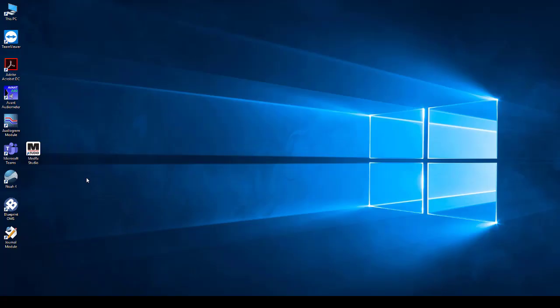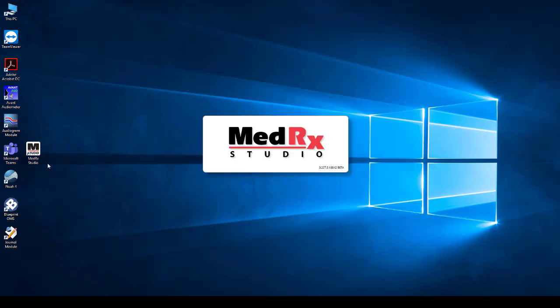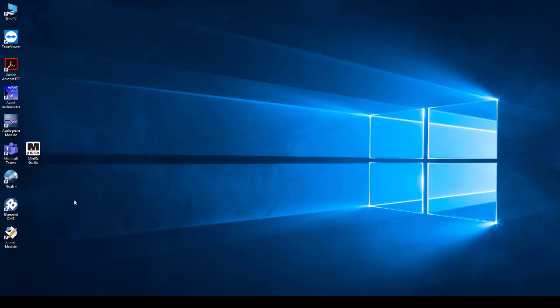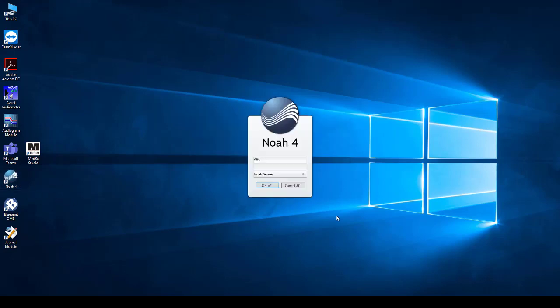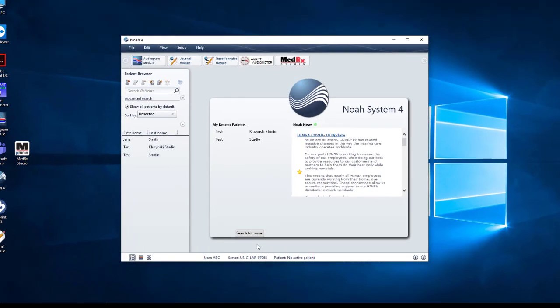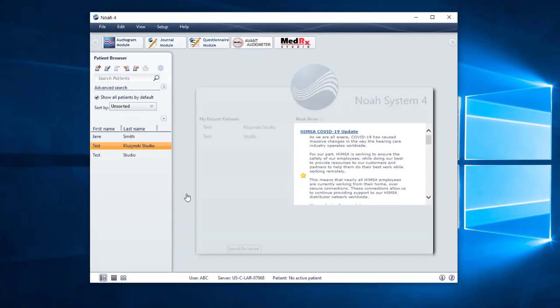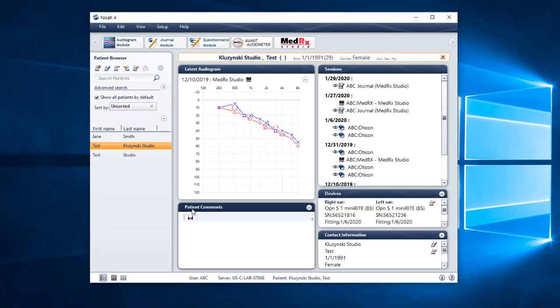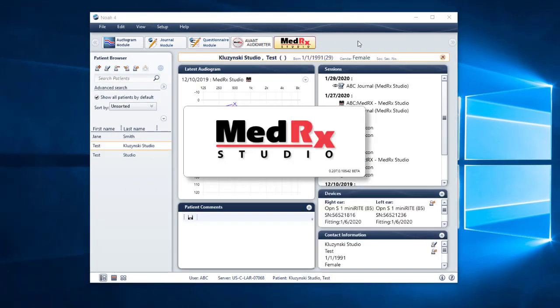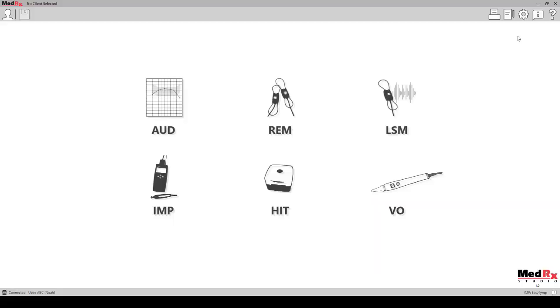To launch the software, click on the MedRx Studio icon from your desktop, or to launch within Noah, open Noah, select a patient, or add a new patient to begin. Select the MedRx Studio option from the Noah modules to launch the software.